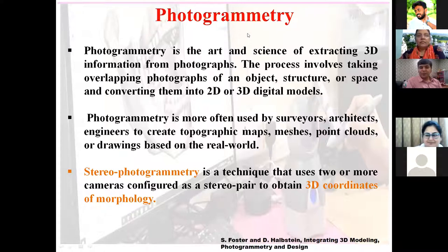Now, coming on to stereophotogrammetry, I am discussing the stereophotogrammetry as the camera which we will be demonstrating in a short while. It is the stereophotogrammetry based technology where two or more cameras are configured in a single unit to obtain the 3D coordinates of the morphology, which you will be appreciating in a while.